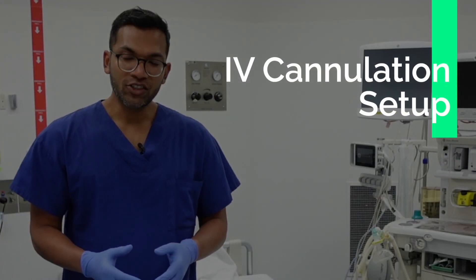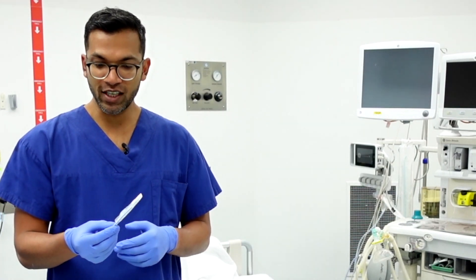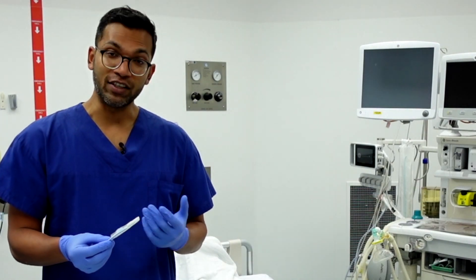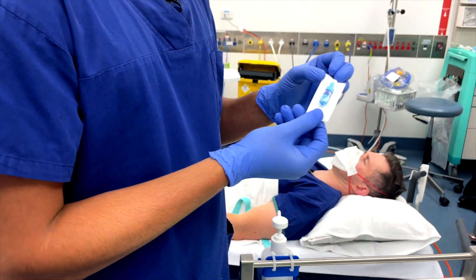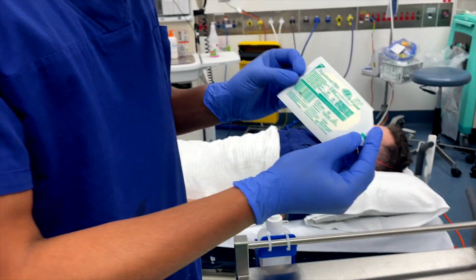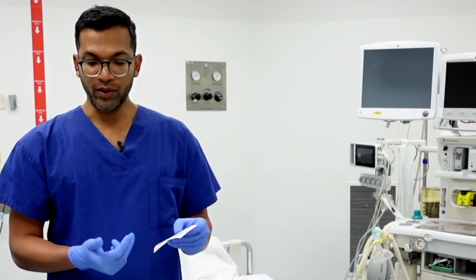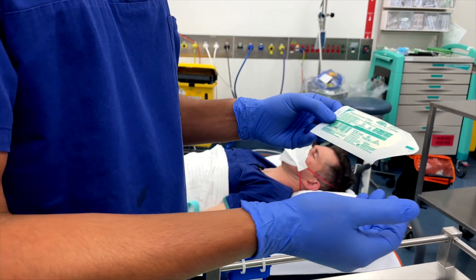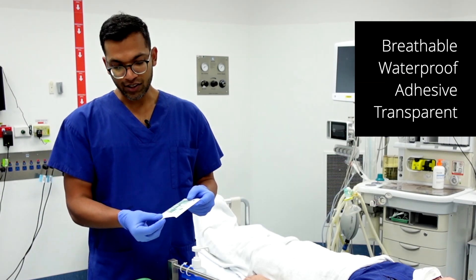There's not too much you need to set up for IV cannulation. I'm using a 22 gauge here just for demonstration — there are also videos of 14 gauge and other difficult cannulations which I'll link above. I've got the IV bung, which caps off the cannula to prevent fluid back and provides a port for injecting fluids and medications. I've also got Tegaderm film — a 3M trademark — which is essentially a waterproof, breathable, adhesive, transparent dressing that sticks nicely and covers everything. There are many different dressing options, but I've used this one for many years.